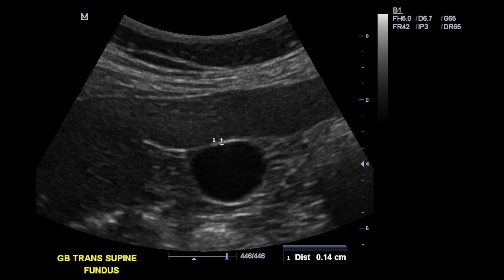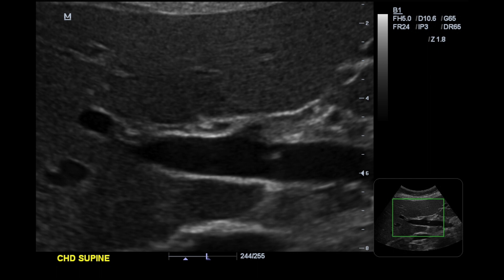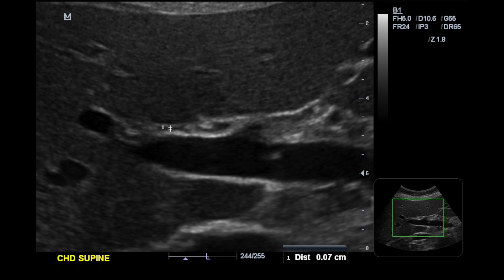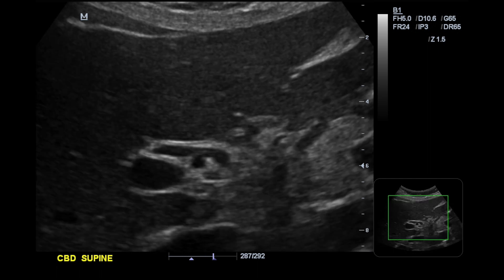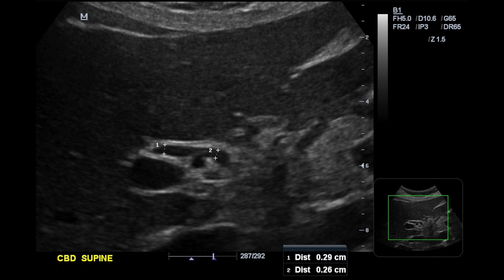At the gallbladder fundus we take a measurement of the wall, being careful not to measure the liver capsule — only the gallbladder wall. Next we image the CHD (common hepatic duct) and the CBD (common bile duct). These are really difficult — I still struggle getting these pictures on certain patients because they are tiny structures. Starting at the CHD, which is more intrahepatic, we look at the main portal vein, try to elongate it, and just anterior to that is the CHD with its bright echogenic wall. We go ahead and take a measurement of the CHD. The CBD is a continuation of the CHD outside the liver, and we try to extend it all the way from the liver hilum to the pancreas head.